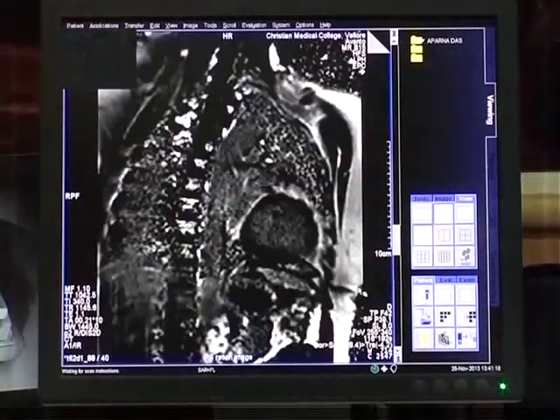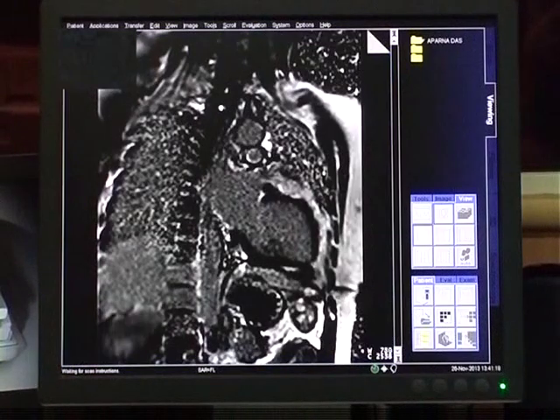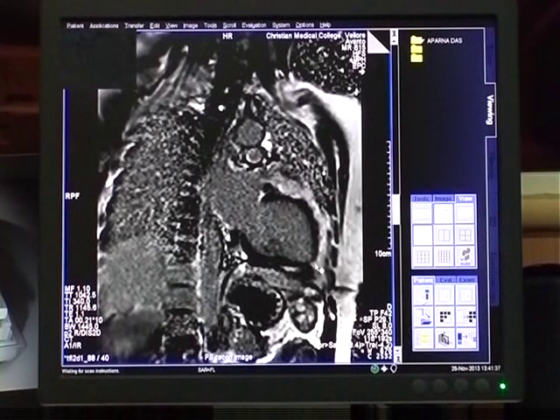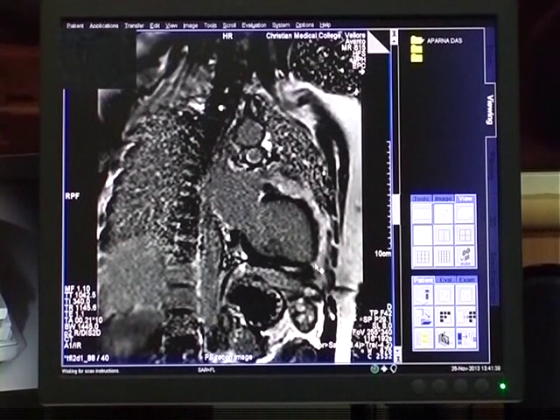The images are transferred to the workstation for calculation of the RV and LV function.